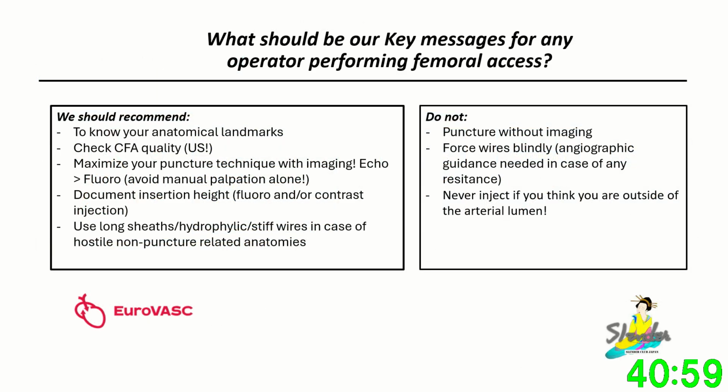So what should be our key messages as a club for any operator performing femoral access? I think we should recommend, first, to know your anatomical landmarks. This is not something that we teach on a regular basis to our fellows. You need to check the quality of the common femoral artery. I think using ultrasound is the best. You should maximize your puncture technique with imaging. So echo is better than fluoro and is definitely better than manual palpation, which we should definitely avoid when you do a femoral puncture. You should document your puncture height by fluoro or contrast injection.